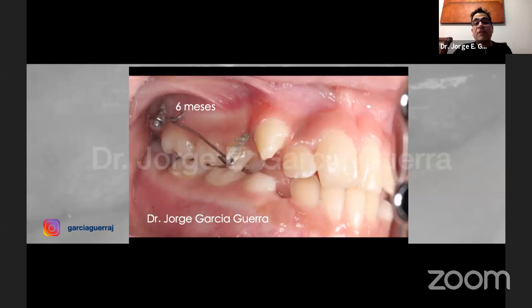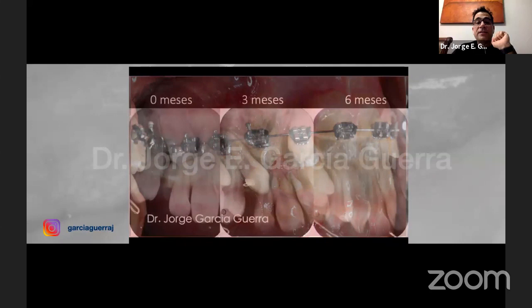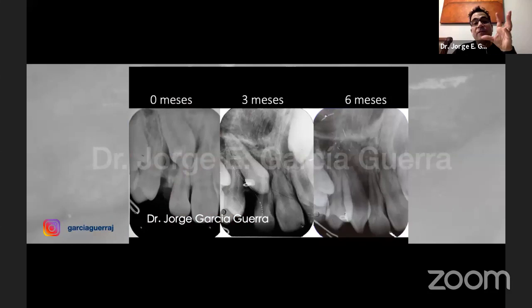Now, the right side was very easy because it was at the root of the lateral incisor, but the one on the left was a little bit more difficult to move. I'm going to show you. Now this is some months later, you can see that our canine is in a better position there. And you can see these are the x-rays. I always take x-rays. It's very important to do this because you see if the tooth is moving or not, okay?